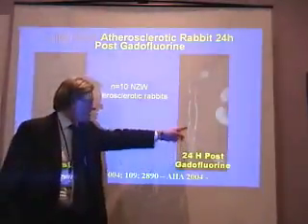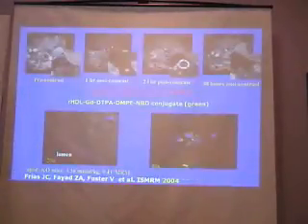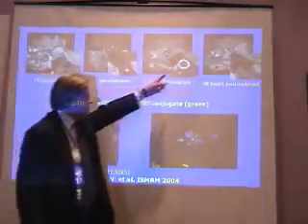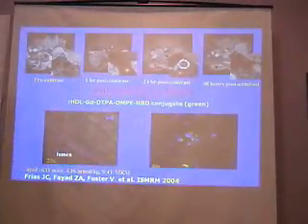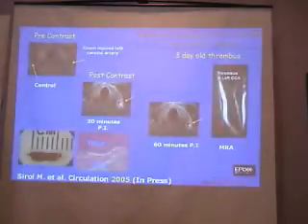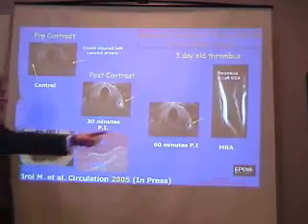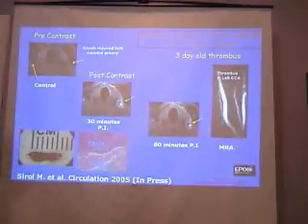Look how nice. This is like immunofluorescence of the aorta where the LDL has been deposited. This is a combination of macrophages and HDL, without going into too much detail, also in an animal model, in an artery which is actually 1 millimeter. And this is the injection of iron particles which go into macrophages, and this is the identification of a 1 millimeter blood clot in the carotid artery of the rabbit by the same mechanism. This is what we call molecular MR.